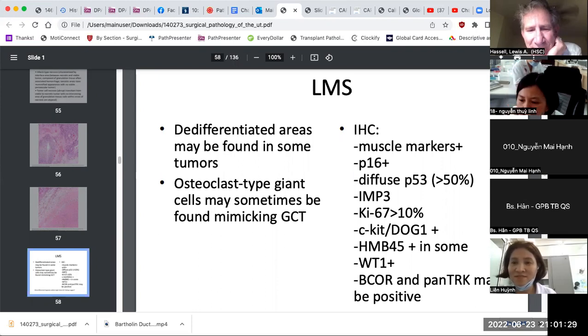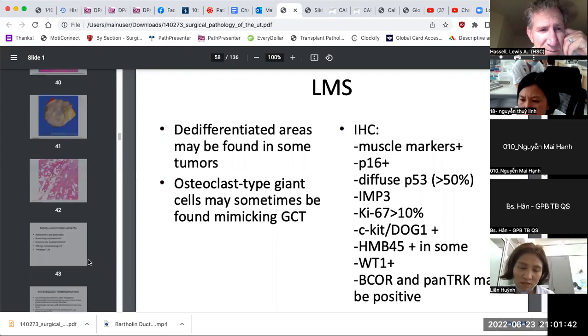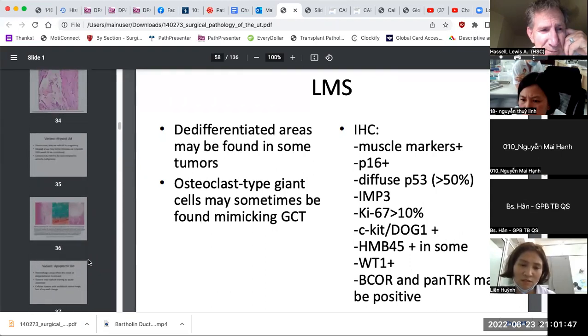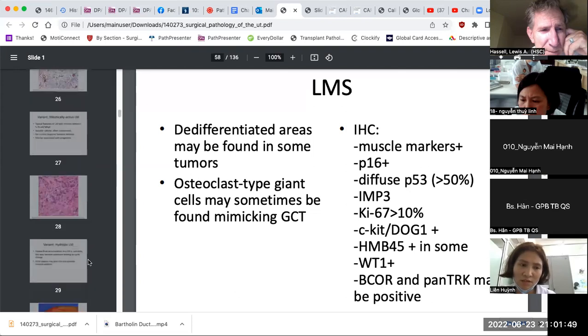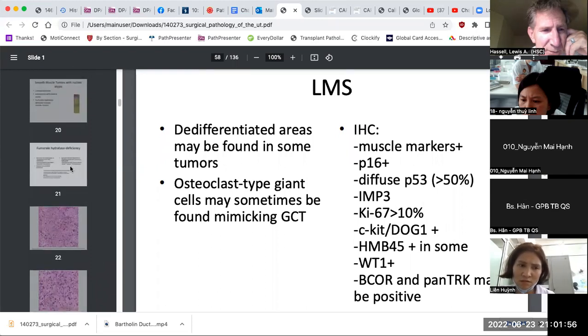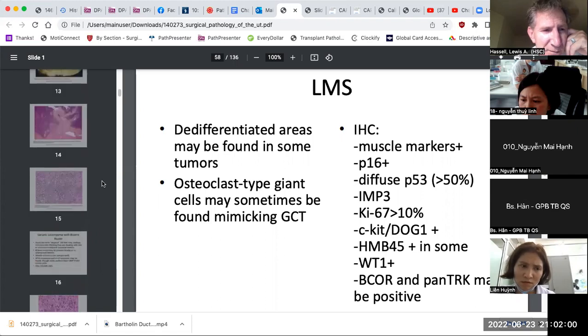I want to ask you about the leiomyoma with the bigger nuclei. You mentioned that P53 or P16 can be positive with this tumor, but some doctors may favor STUMP if the P53 or P16 is positive. So what is the positive rate of P53 or P16?